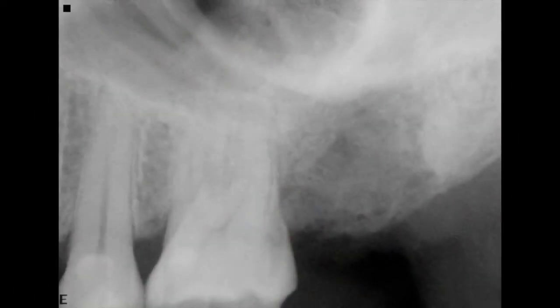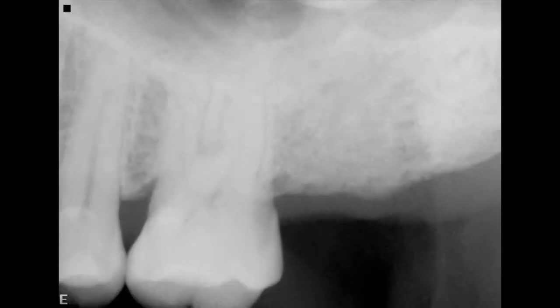Importantly, the OsteoGen inside of the OsteoGen plugs is a low-density graft, so it will show radiolucent on the day of placement. As the OsteoGen crystals are resorbed and replaced by human bone, the site will become radioopaque. This provides a great indicator of sufficient bone formation for implant placement.